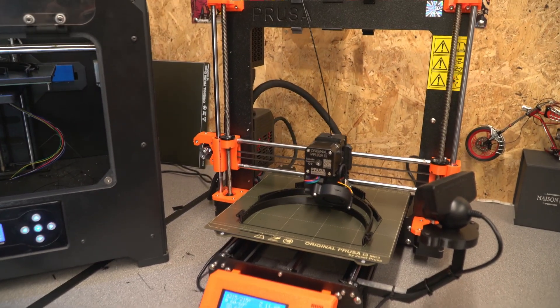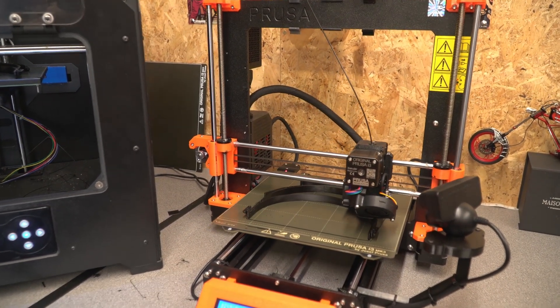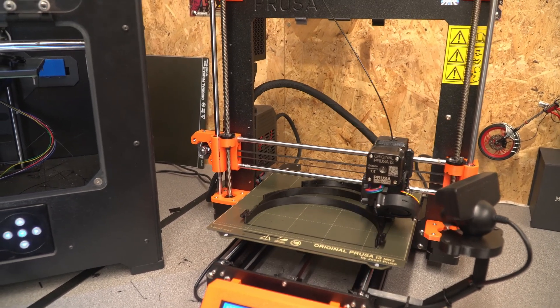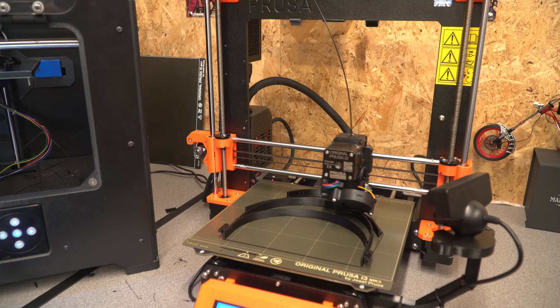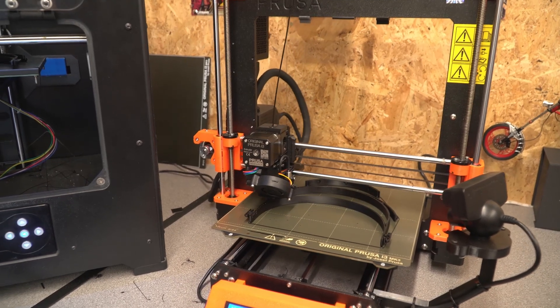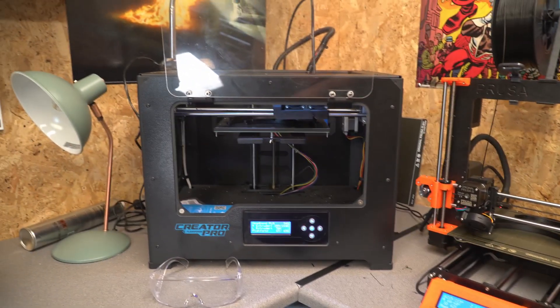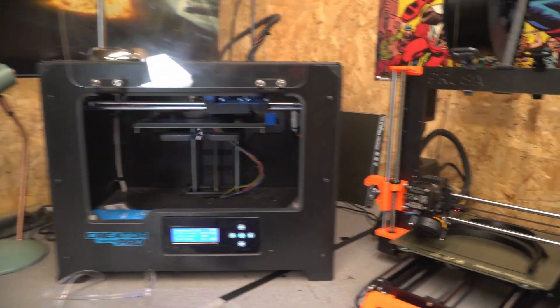It is worth remembering that if you are doing the fast prints you are pushing your printer to the max. Currently because I'm doing these in PLA I found that the fast prints just weren't working well, so I've moved back to standard speeds but I actually have both printers working at that rather than just the one.